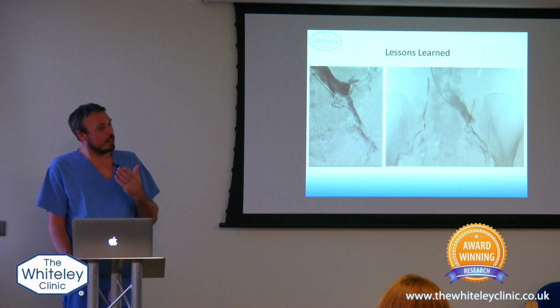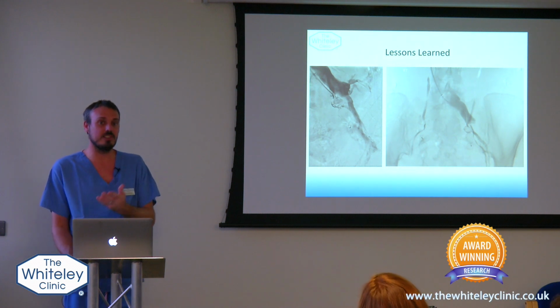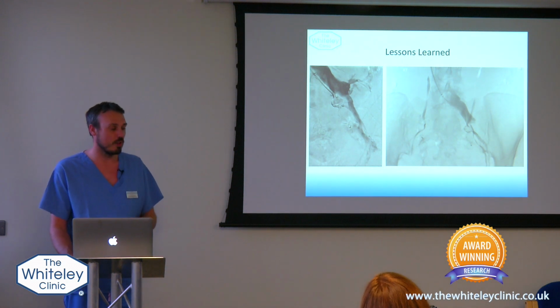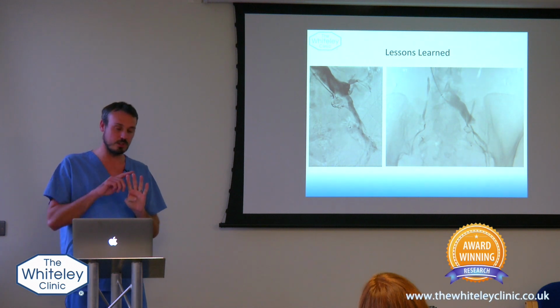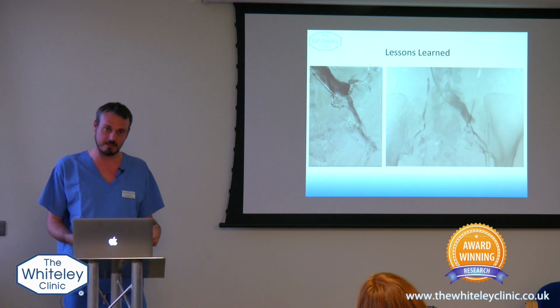And you asked the question really about how many coils or what veins, to what extent do we go down into the veins, and how many of them do we block off. So essentially there's 4 territories. There's 2 ovarian veins that come down, and there's 2 internal iliac veins.